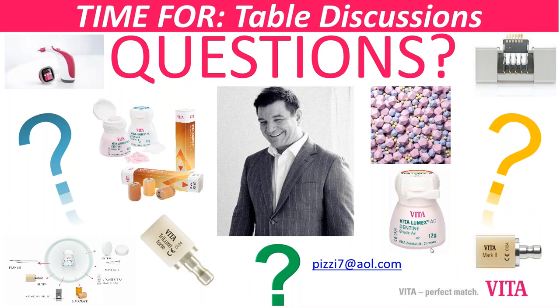If we did, we'd work in a CR position, which we always do anyway on a patient like SD. And I feel very comfortable tweaking it 1, 2, 3 millimeters if I needed. But I don't remember if we actually went back and tweaked our vertical. I think our OVD was fine. And in truth, because SD is class 2, with class 2 patients, especially when they're class 2 div 2, you don't really want to open those verticals too much because they become more extreme in their position.